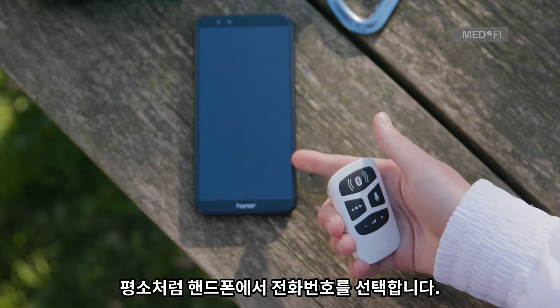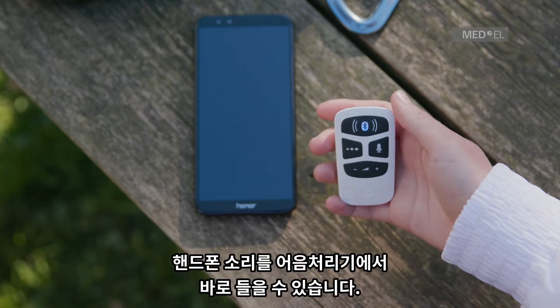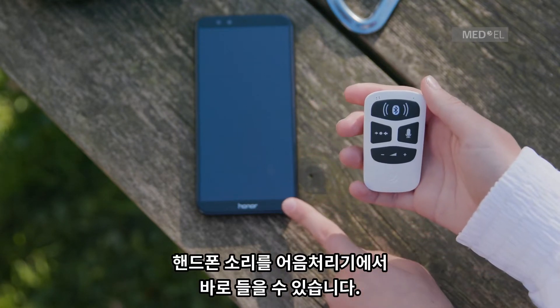To make a call, select the number or contact on your phone as normal. The audio from your phone will then be streamed to your audio processor.